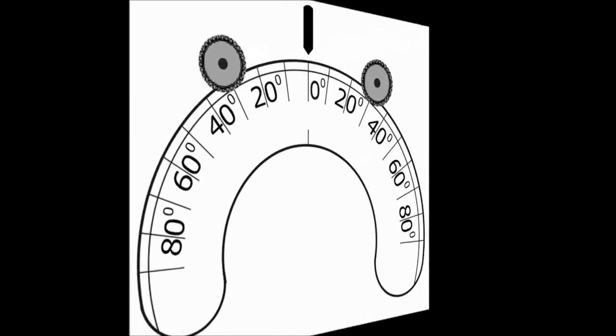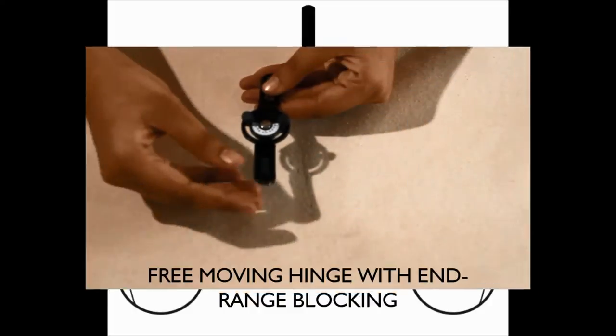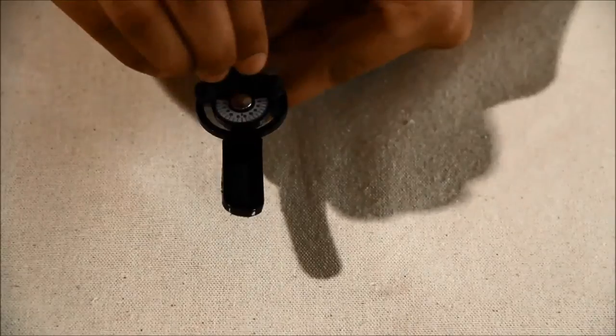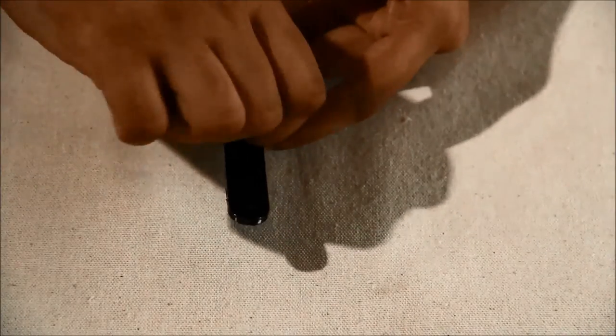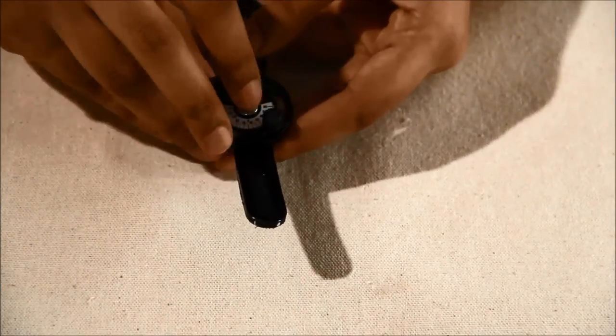If you wish to restrain wrist movement, you can set up a static hinge by lining up the arrow at 0 degrees on the hinge. To introduce range of motion, line up the arrow on the hinge with the greatest amount of extension desired. You can control the range of motion by changing the position of the adjustment screws along the circumference of the hinge.